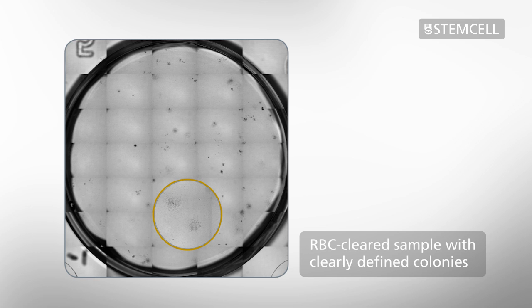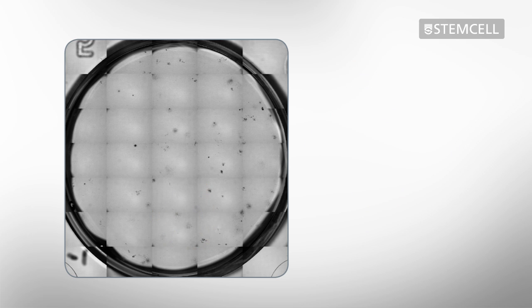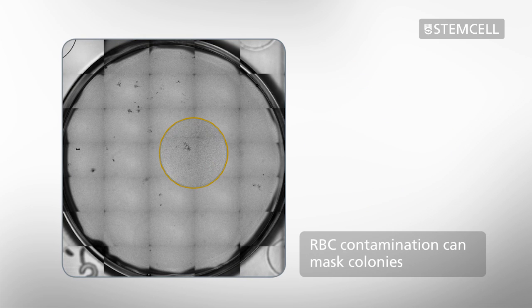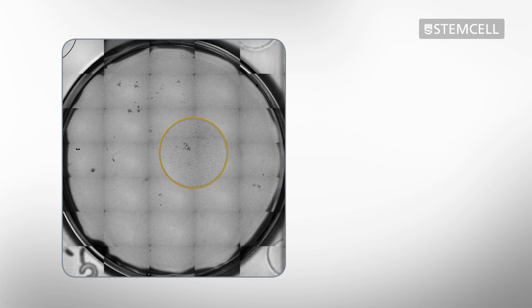Some colonies may be masked or obscured by the contaminating red blood cells and may be missed during counts. Another issue is that areas of dense RBC accumulation could be mistaken as colonies, resulting in false positives.